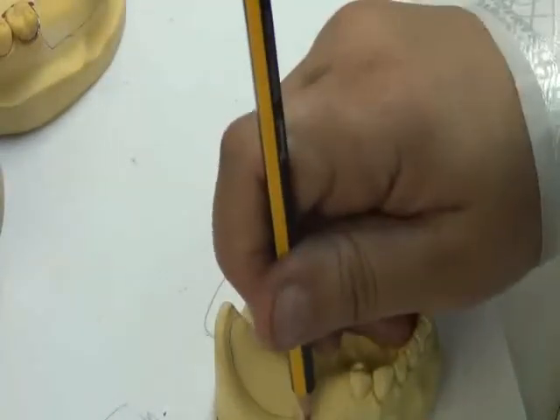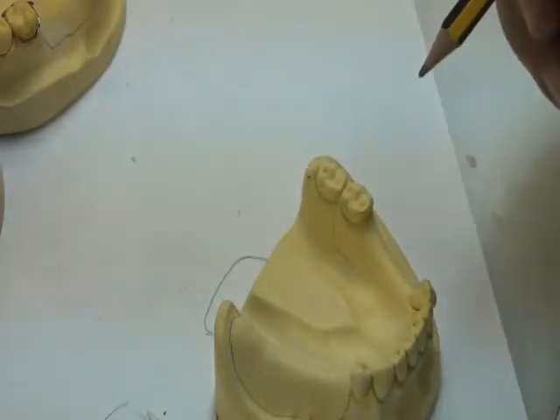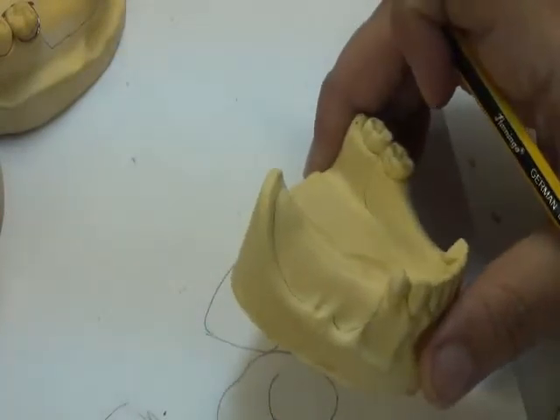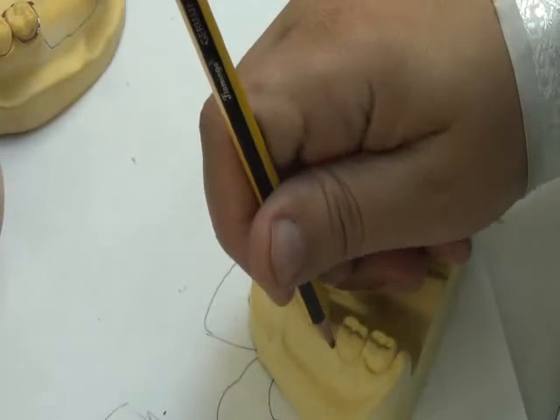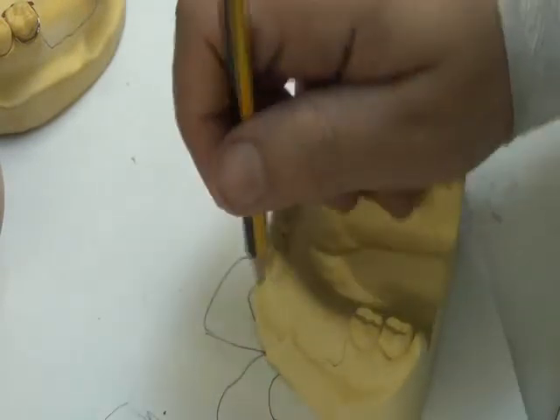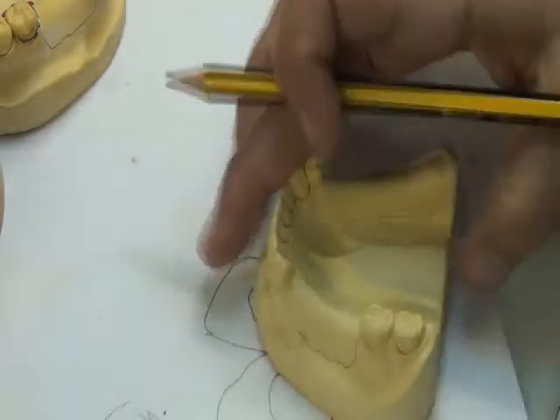In this area, go back with a round angle and go back vertically to the tooth. This is the free end saddle area. In the bounded saddle area, buccally, I go down from the abutment teeth. I don't need to go to the full length, and I end my base there.